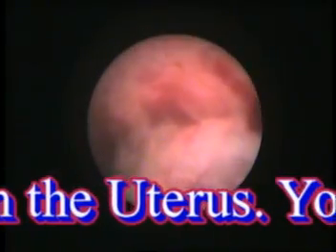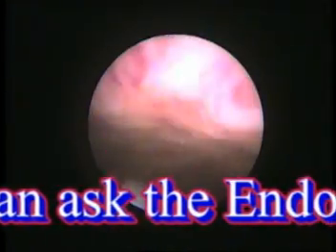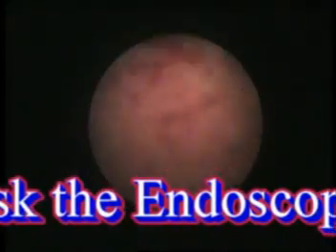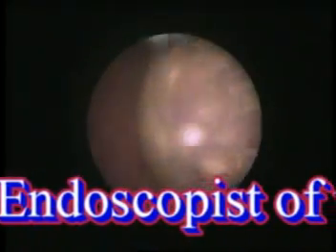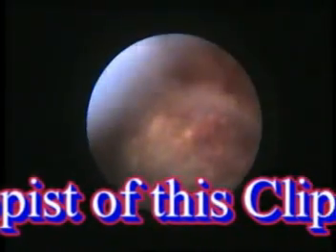Apply your brain and try to diagnose the case. If you are unable to diagnose, you can ask Dr. Bhandari, whose email address is given in the strip running in the video clip.